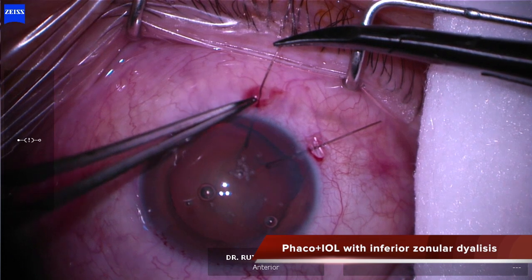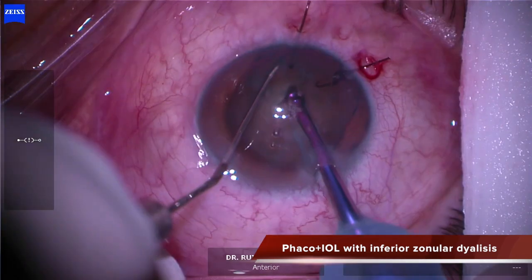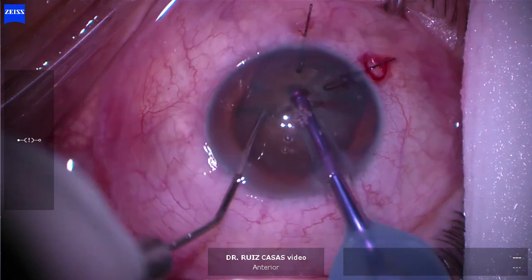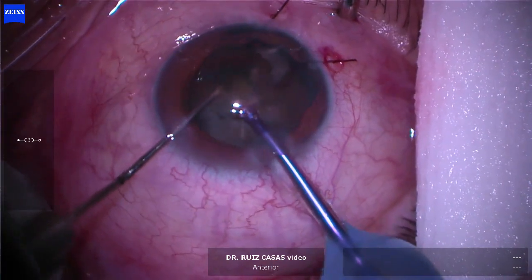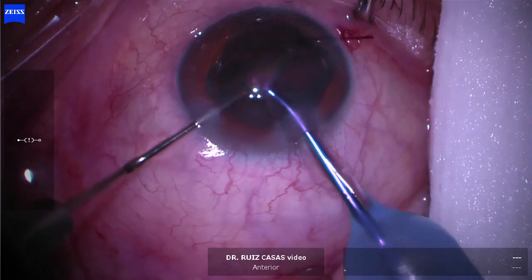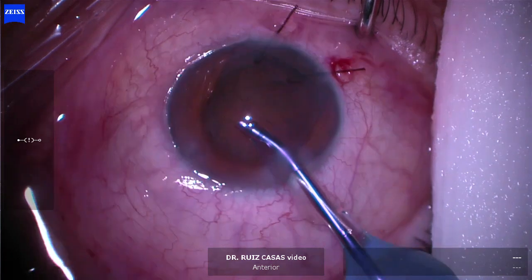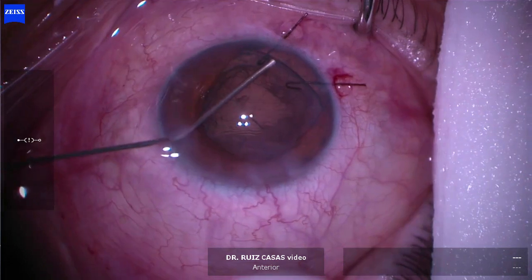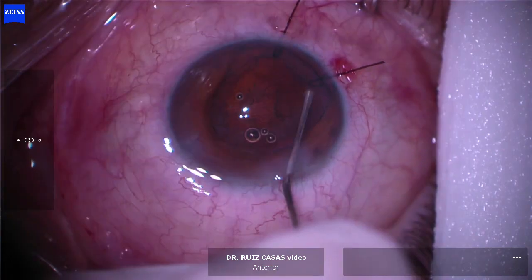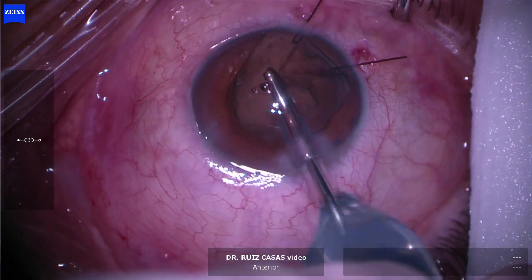I'm performing the capsulorhexis and unfortunately I didn't use any dye because I was concerned about dye migration into the vitreous space. I had trouble doing the capsulorhexis because I could not see it properly. Anyway, I managed to perform it, and after performing the lens removal with a stop-and-chop technique, I rehydrated and removed the cortex remnants.